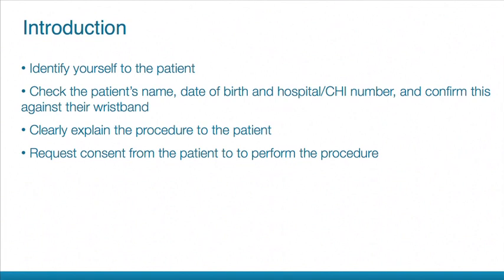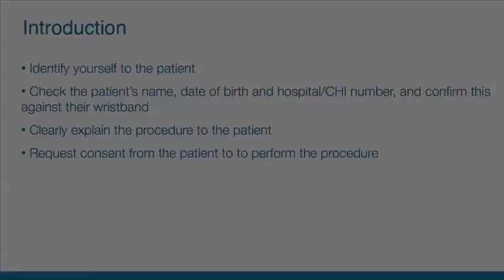Before commencing the procedure, identify yourself to the patient. Check the patient's name, date of birth, and hospital or community health index number, and confirm this against their wristband. Ensure that the patient understands why they are having this procedure and request consent before continuing.